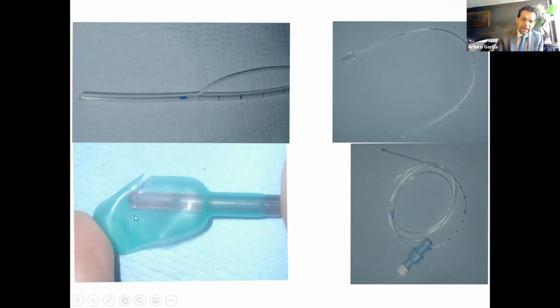This is the rectal catheter. As you can see here, we always do a small cut in the balloon at the end of the catheter. Most of the catheters we have now in the market come with this small cut already done. But if yours doesn't have this slit cut, always do it before inserting the catheter. Remember, the balloon is mainly designed to stop feces from blocking the catheter. If you don't do this small cut and you start purging and putting water into the rectal catheter, in the end you end up measuring the pressure inside the balloon, not inside the rectum.